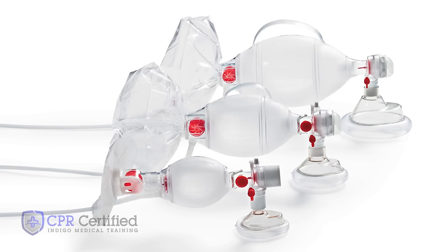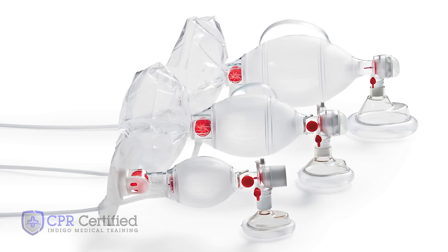There are adult, child, and infant size Ambu bag sets. If available, use whatever is appropriate.